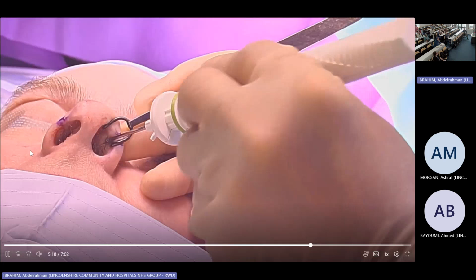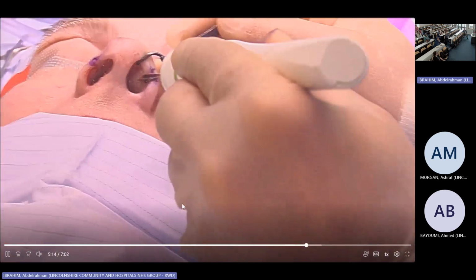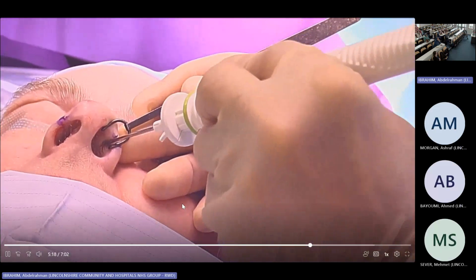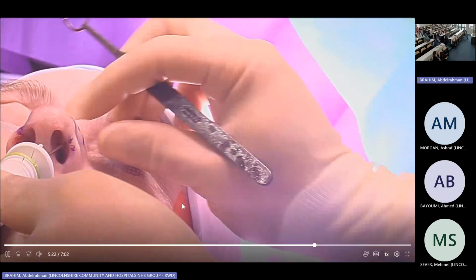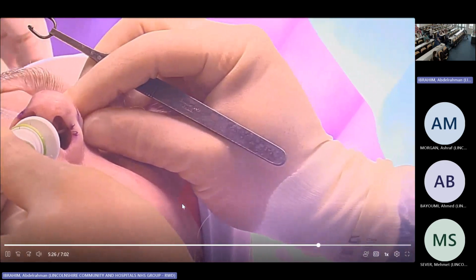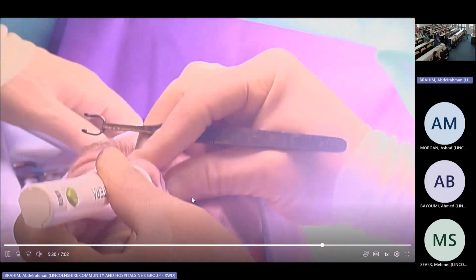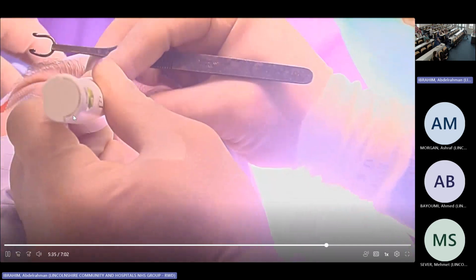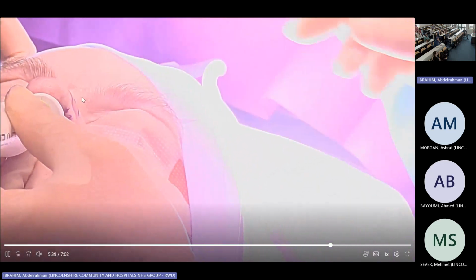The same way. So you go in. The pivot is toward the skin inside there. Okay, 90-degree towards the septum. Go around and then reach until you feel the end of it at the top marker. And once you're in, you just push the button. This button, the lower one, is mainly to open it and close it. The second one is to release, which is the big one.